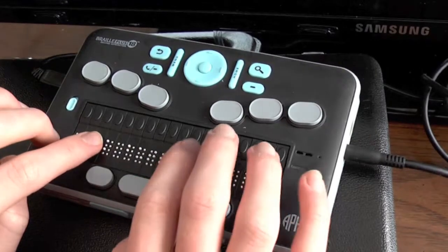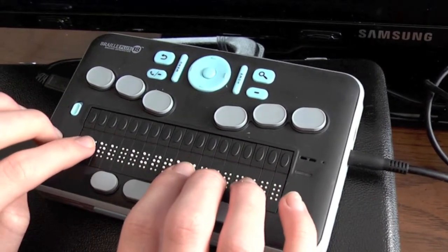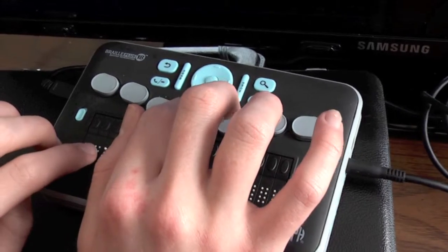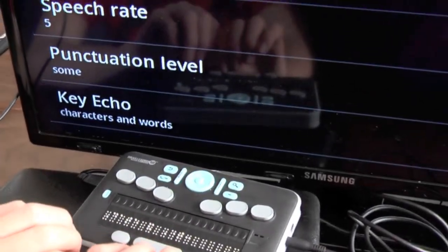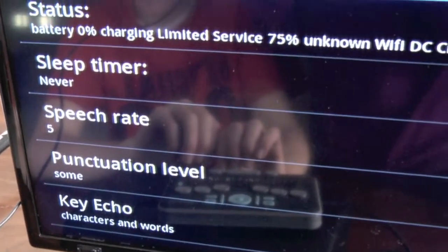If we didn't want to save what we had done, we could press the back key, which would just get us out of this dialog without saving any changes. But I'm going to press select on the OK button, which will save the date and time that we have just set. Braille and speech preferences. Date and time, 5:30 p.m. Monday, April 15, 2013, 1 of 9.